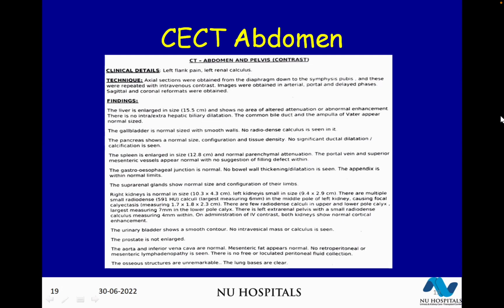Standard renogram. What is the advantage of a standard renogram? What does it tell you? So it tells the perfusion and function of the kidney. It tells you whether there is a possibility of obstruction to the drainage system. You see that curve, isn't it? Yes, sir. All these curves, type 1, 2, 3, 4, type 3A, 3B, all that is there.